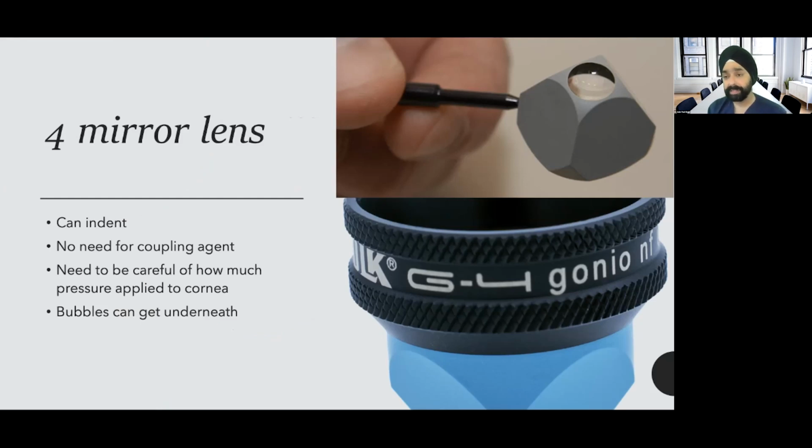The 4-mirror lens comes in a handheld little handle up there on the top, or you have a larger lens in the bottom here, where you hold it on the eye, either way on the eye. What's nice about this lens, again, is you do not need a coupling agent, which is nice from an efficiency and flow perspective. But what's nice about a 4-mirror lens is it allows you to perform indentation or compression gonioscopy, which we'll talk about in a second.